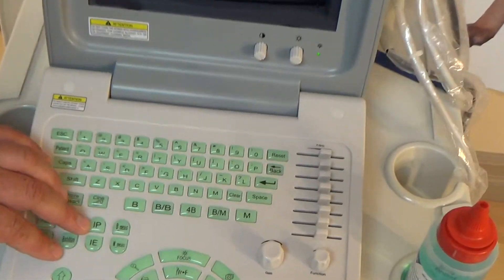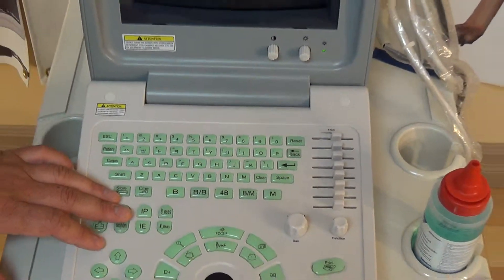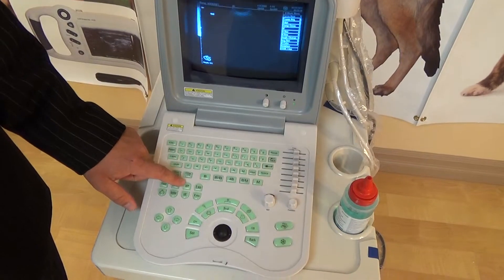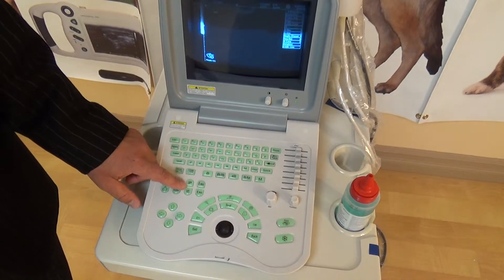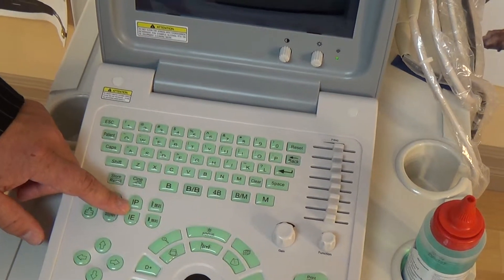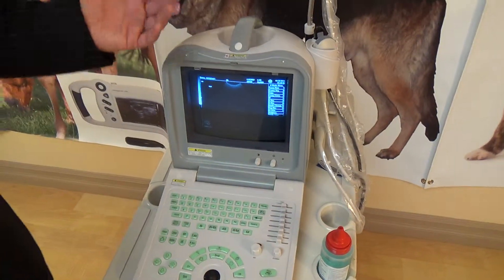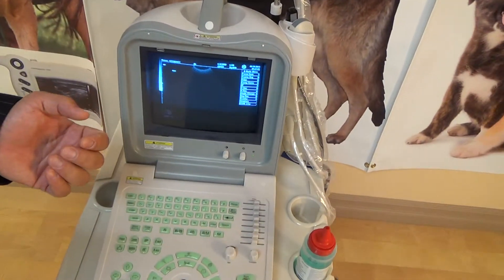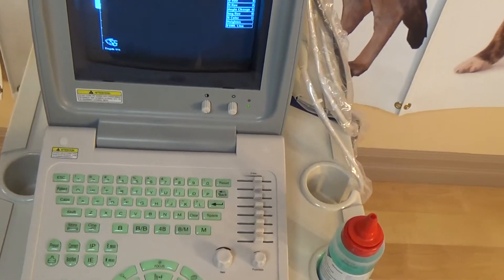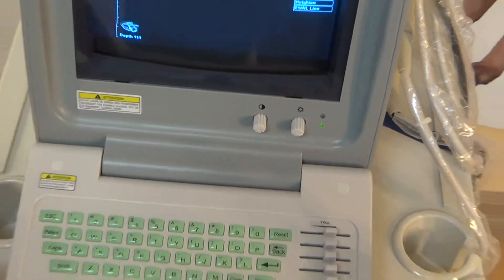Moving along, there are two buttons: IP and IE. Those are specifically related to the physics behind the ultrasound machine. IP stands for image post-processing and IE stands for image edge enhancement. The post-processing is how the machine does some of the physics calculations with the images it obtains, and the IE is how it overlays and adjusts the images. You don't have to worry about that, but some people who are very savvy with these machines like to play with those buttons.